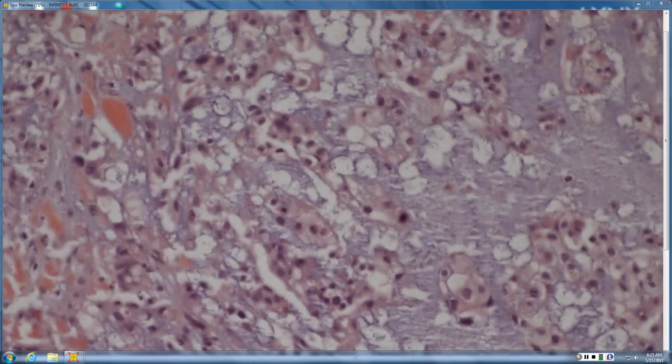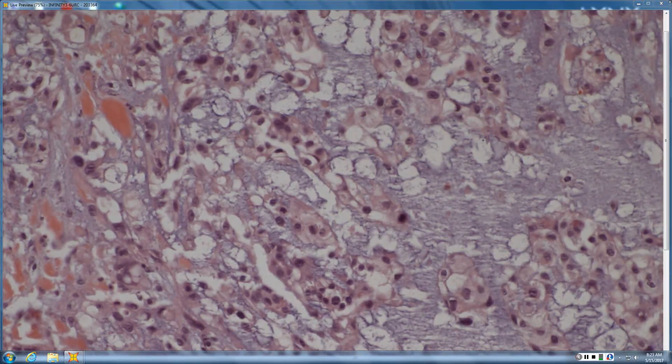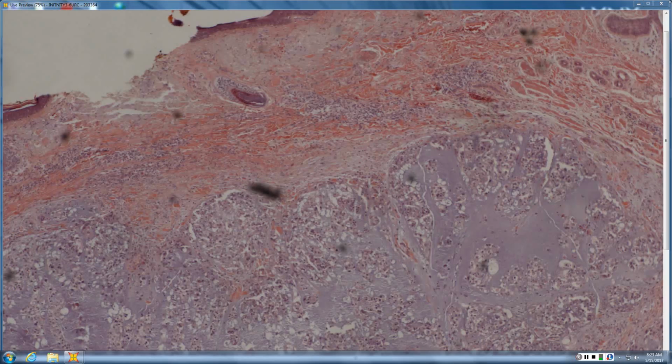Parachordomas fall into the myoepithelioma group, everything from pleomorphic adenoma to mixed tumor to malignant myoepitheliomas in skin. True chordomas are axial, commonly presacral, metastasized. This poor guy looked like the Michelin tire man with about 40 pounds of metastatic chordoma in his skin.